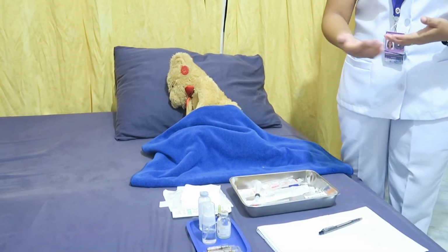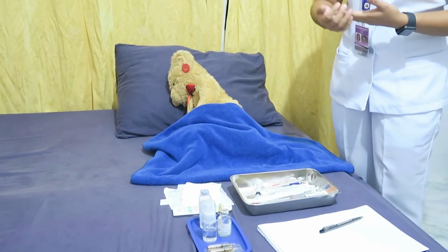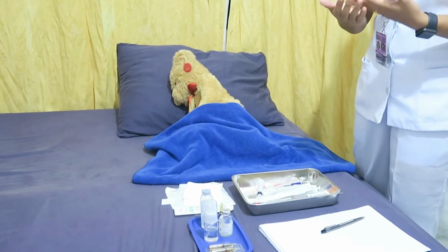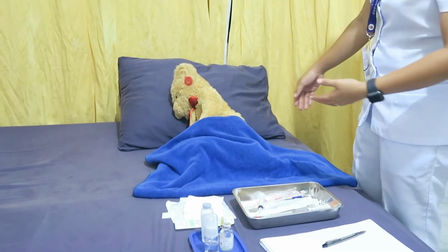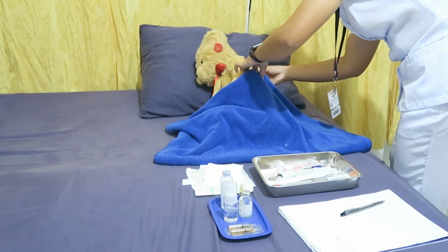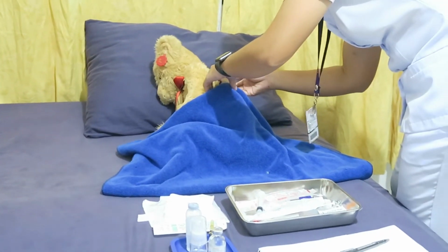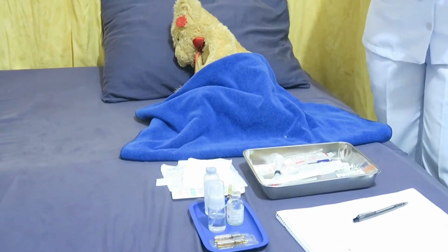The rationale for that is that a site where the skin appears to be healthy and free from irritation and inflammation reduces the discomfort of injection. So let's find the site that we need to use. Okay, thank you, ma'am.